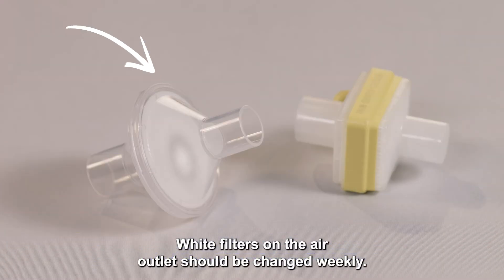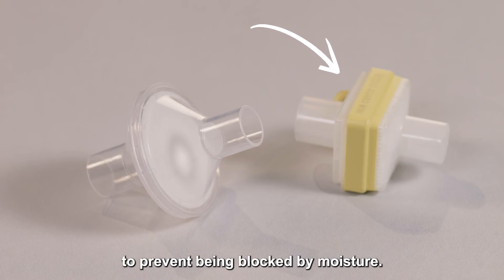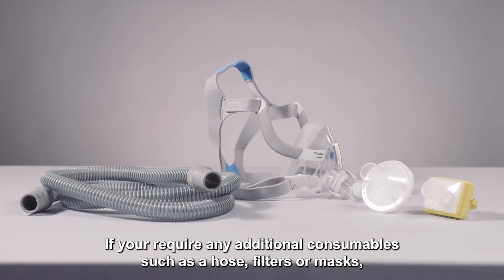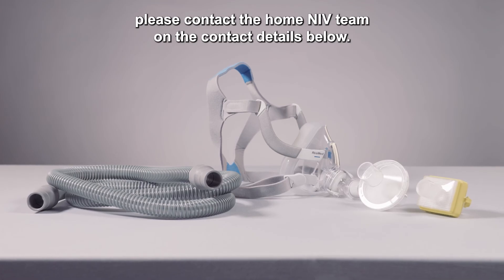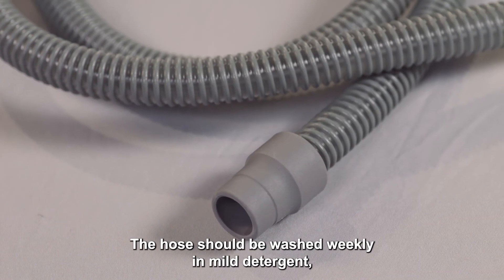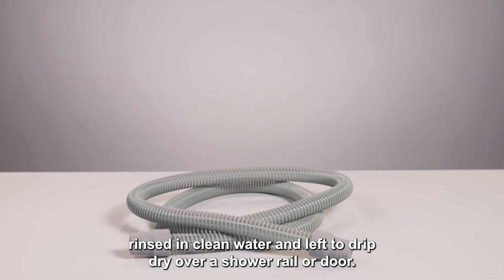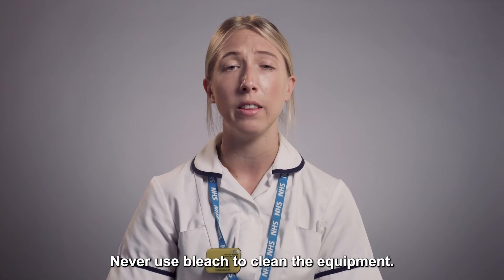White filters on the air outlet should be changed weekly. Yellow filters used with humidification should be changed daily to prevent being blocked by moisture. If you require any additional consumables such as a hose, filters, or masks, please contact the home and IV team on the contact details below. The hose should be washed weekly in mild detergent, rinsed in clean water, and left to drip dry over a shower rail or door. Never use bleach to clean the equipment.